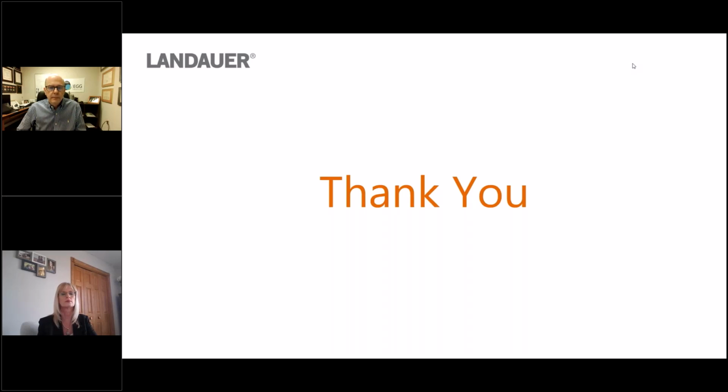What are your average run rates for using the EGNEST? I'm not sure what that refers to. It says example PCI equals 7.5 FPS. Oh, the frame rates. Yeah. Well, it depends on the place. Some places are even at 3 something. I would say probably the average is between 7.5 and 15, but these days almost closer to 7.5.